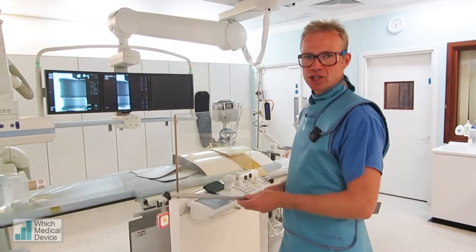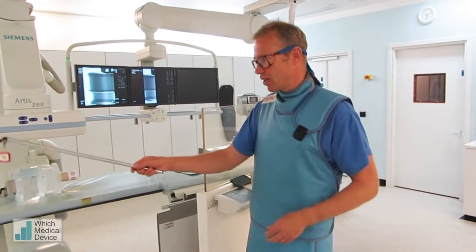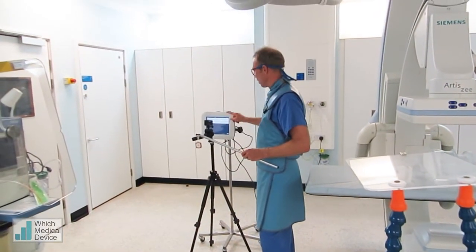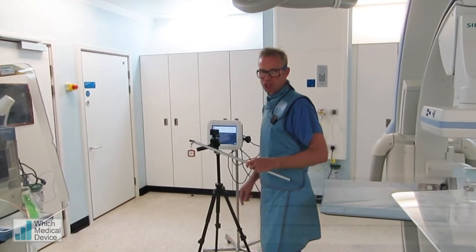What we've got here is the I2 radiation real-time radiation dosimetry system, which you can just see over here. And we've got four badges which are connected to this system via Bluetooth, and these will give a real-time readout of radiation, actually as you're screening and performing procedures.